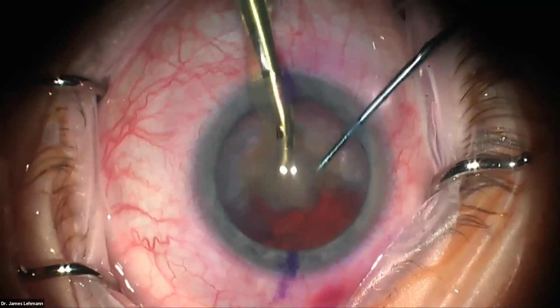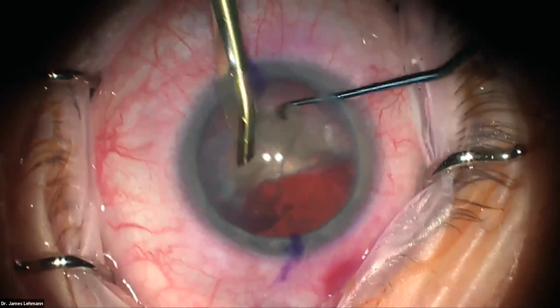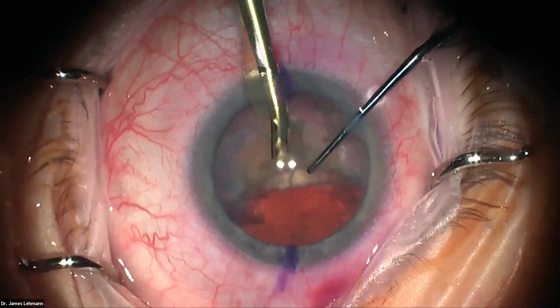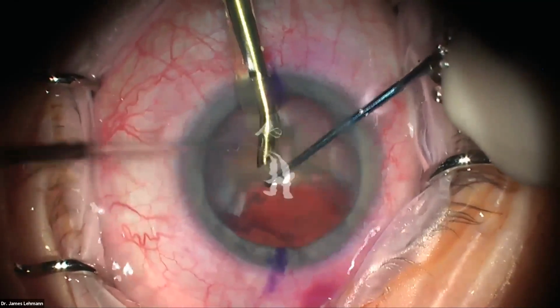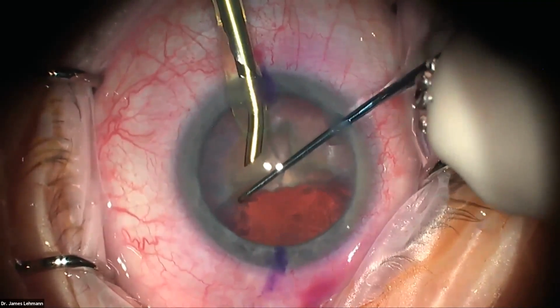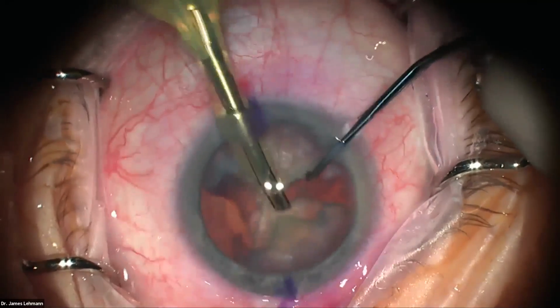So I'm eating this a little higher than the iris plane. Guilty of that, because I see that capsule doesn't have any cortex protecting it, you see? Most mature cataracts don't have any cortex, as we've discussed, and so it just has like a little blotchy stuff. Some BSS, please. Now again, look what I'm doing. I'm not going and grabbing this and trying to bring it over here or anything. I'm rotating the pieces around, and I'm putting it across from me before I go grab it.